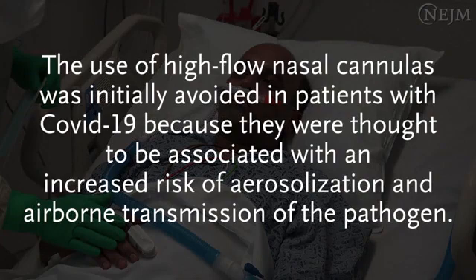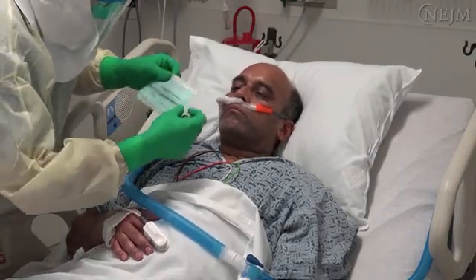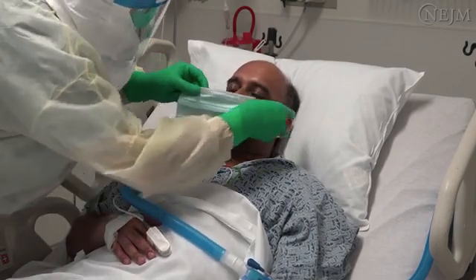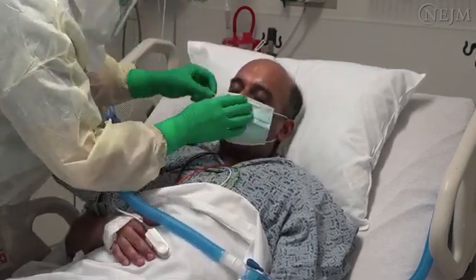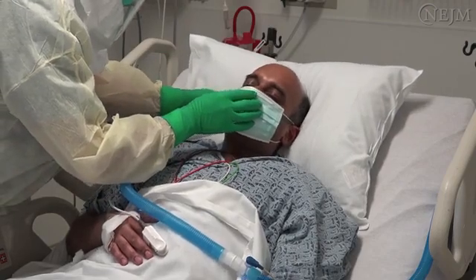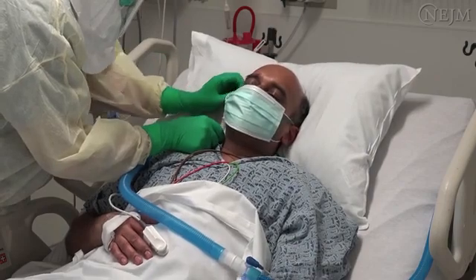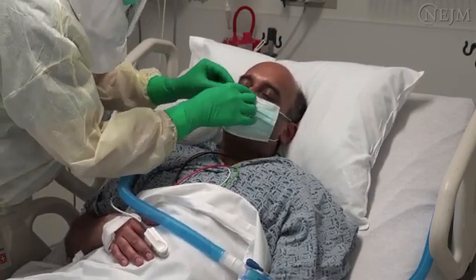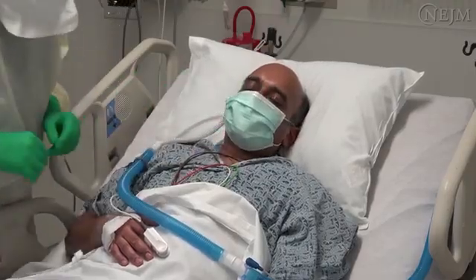The use of high-flow nasal cannulas was initially avoided in patients with COVID-19 because they were thought to be associated with an increased risk of aerosolization and airborne transmission of the pathogen. However, emerging data suggests that this device may be used in patients with less severe forms of COVID-19 pneumonia without posing major risks to healthcare providers, as long as appropriate personal protective equipment is used and precautions against airborne transmission are taken. A surgical mask can be placed on the patient to reduce droplet deposition and the risk of particulate contamination.